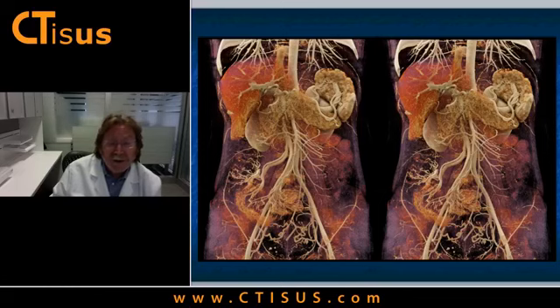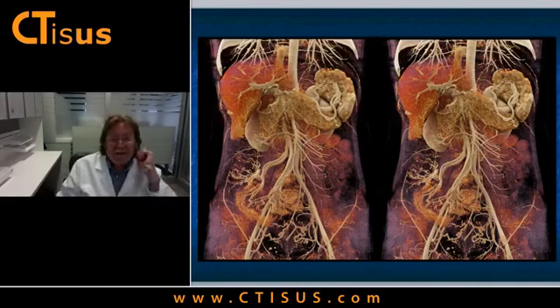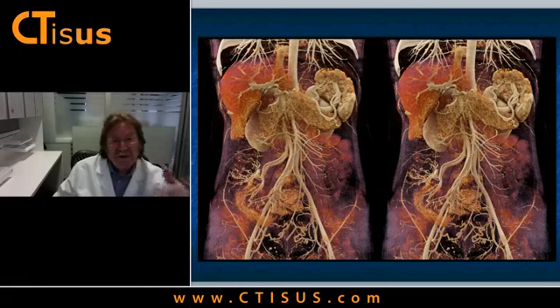With texture mapping, can we determine what a tumor is specifically, potentially what its outcomes are? We talk about things like radiomics, different information from the data set. And one of the things cinematic provides is really a way of thinking about the data that's a bit different than conventional wisdom. I think that becomes very important for us. I think we all spend a lot of time looking at images. And I've made this point before that just looking at your screen, you're just using 10-20% of the data. If you want to use 100% of the data, you're going to need to figure out ways of really getting into that data, displaying the data, understanding the data.